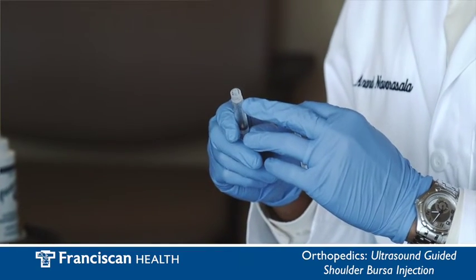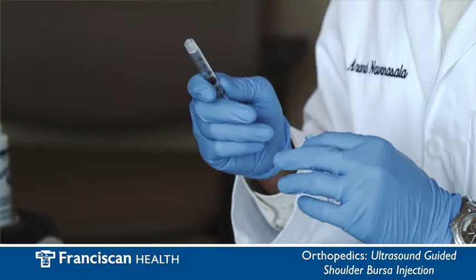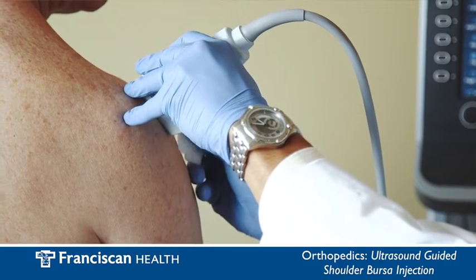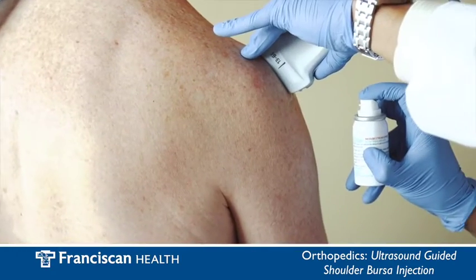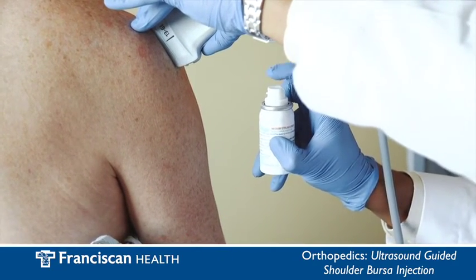In this syringe is a combination of a steroid and anesthetic medication which I will use for the injection. I will then cleanse and sterilize the area with chloroprep and apply a topical numbing spray to help decrease the pain that may accompany the initial injection.